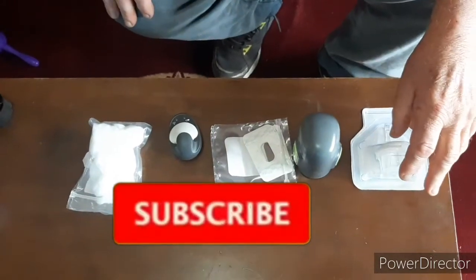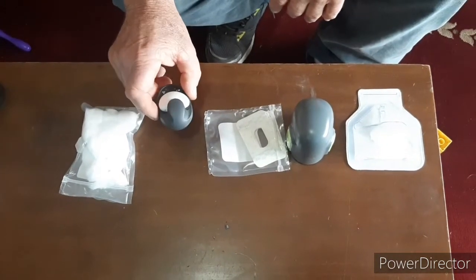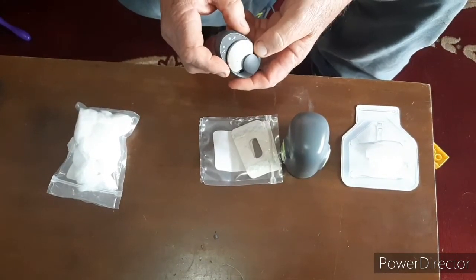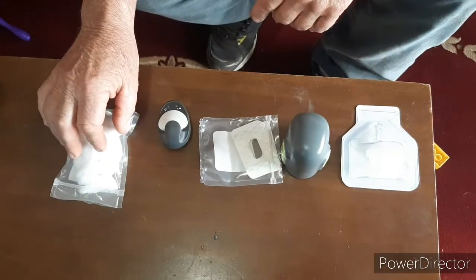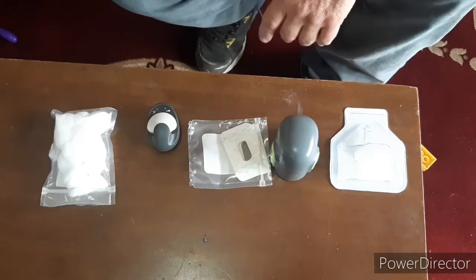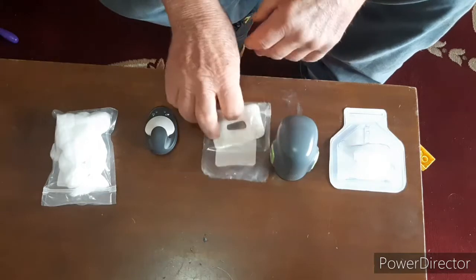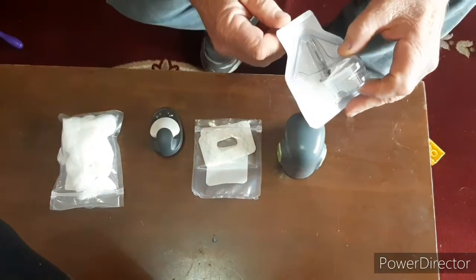I'm going to apply a new continuous glucose monitoring sensor. I've got the actual sensor in its charging pad, a system of alcohol wipes — I use cotton wool and alcohol — and these self-adhesive strips to keep the sensor in place once it's positioned.